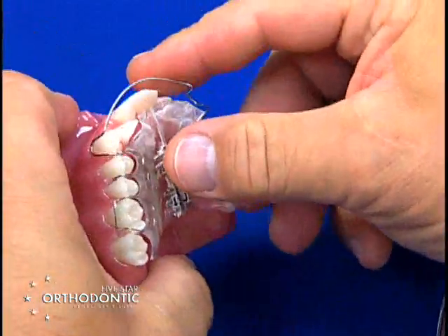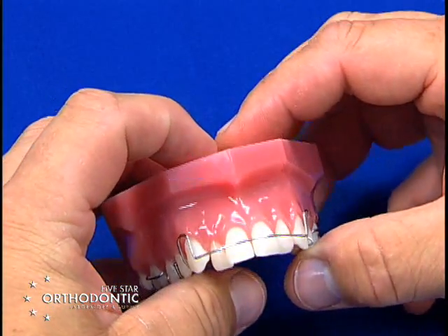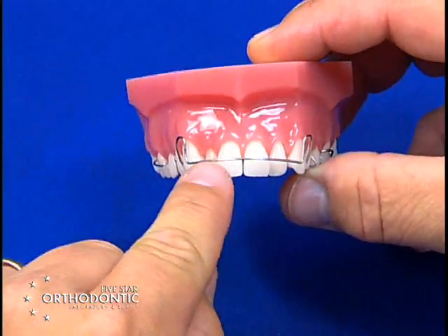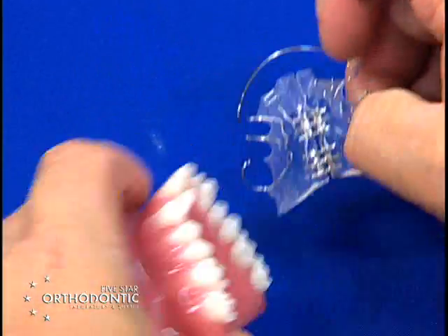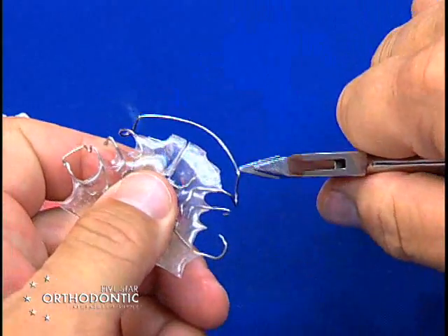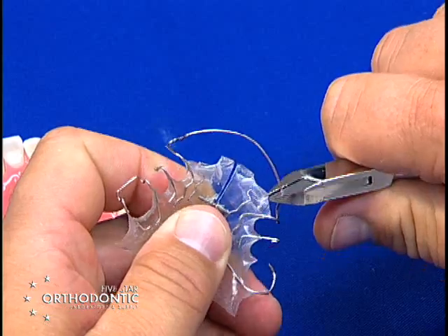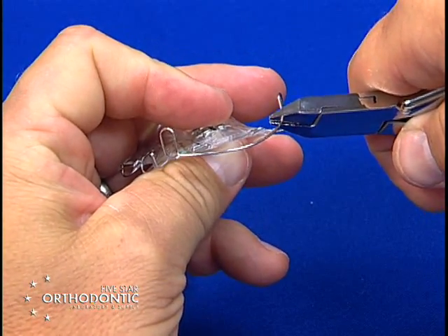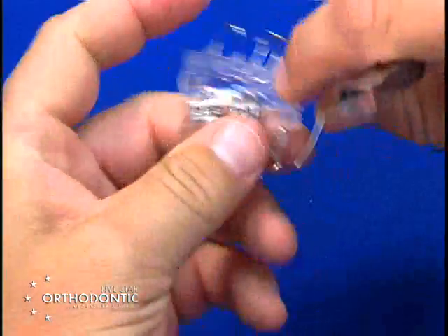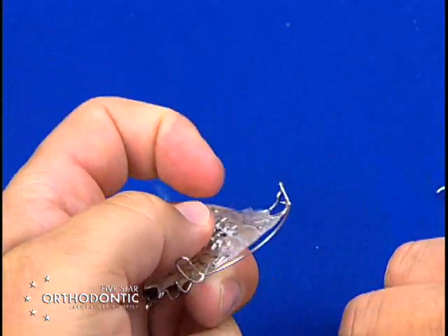Now I have over-activated just to show the process, but this will also take the bow up gingivally. To level the bow, you have to go to the 90-degree bend on the labial bow, place right in the corner, and squeeze. Squeezing the labial bow in the corner brings it back down incisally — do this bilaterally, squeezing both sides, which will then level your labial bow.